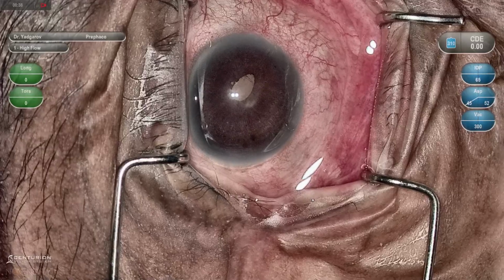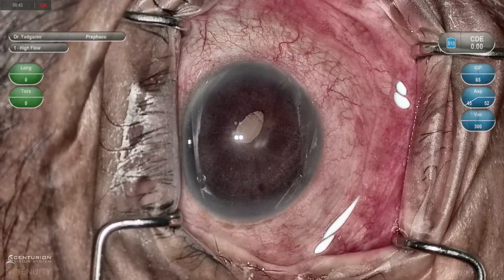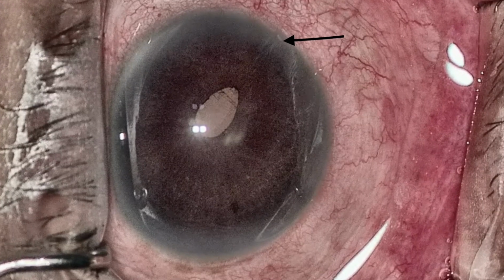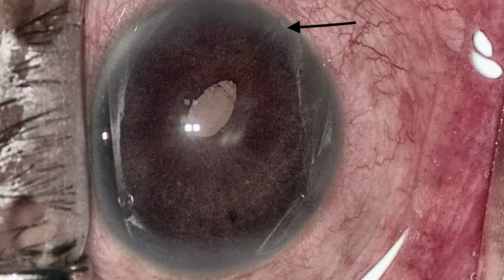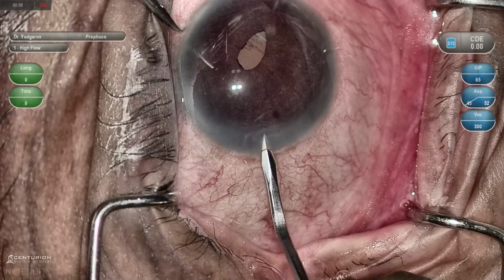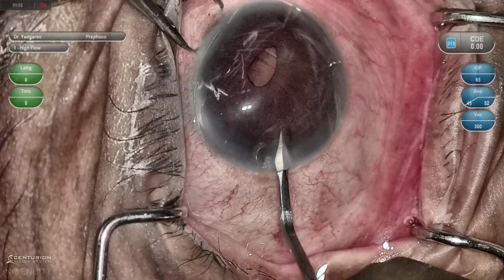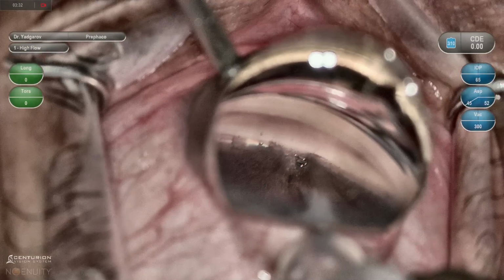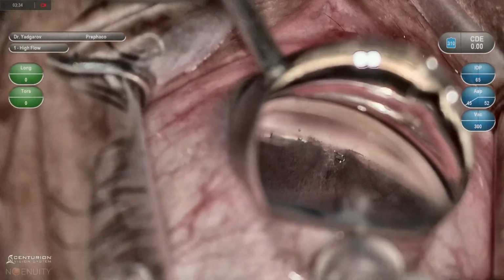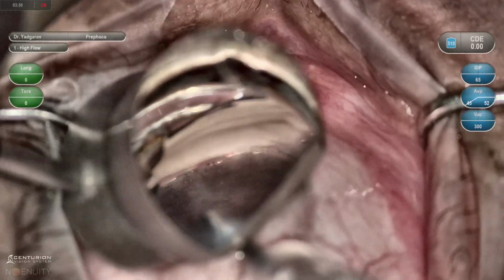This next case is an interesting one in that this patient had a very protuberant postoperative inflammation that caused PAS to not only occlude the Hydrus inlet, but it also peaked the pupil, as you can see there. After making my 1.5 millimeter incision and injection of viscoelastic, visualization of that Hydrus inlet confirms that substantial amount of PAS.